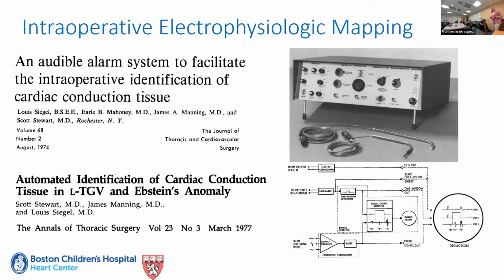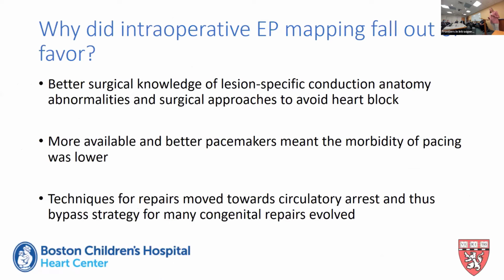So a way to potentially have this be contained within the surgical field rather than relying on an extra operator. So really, with all this research, the question is, why did this fall out of favor? Why did we stop doing this?